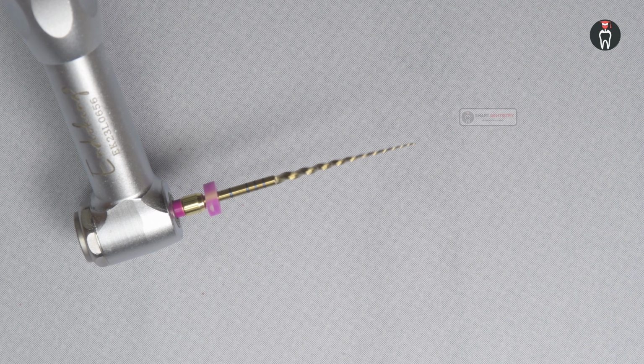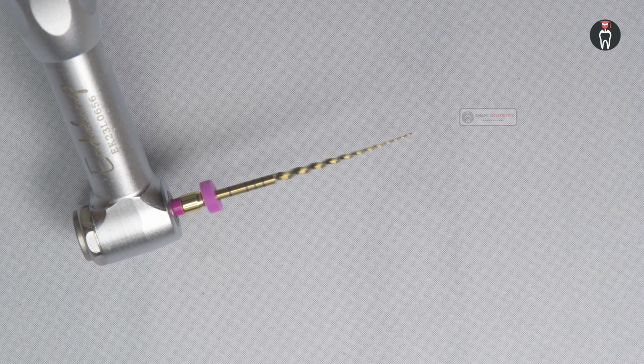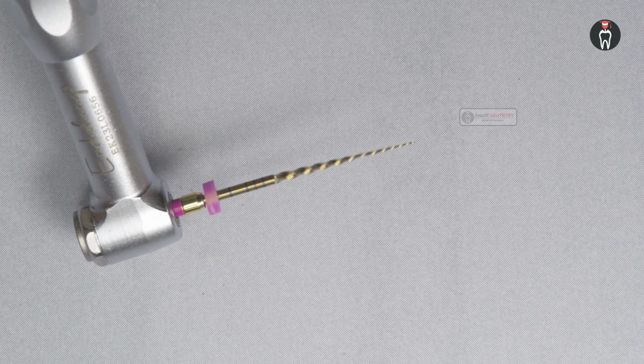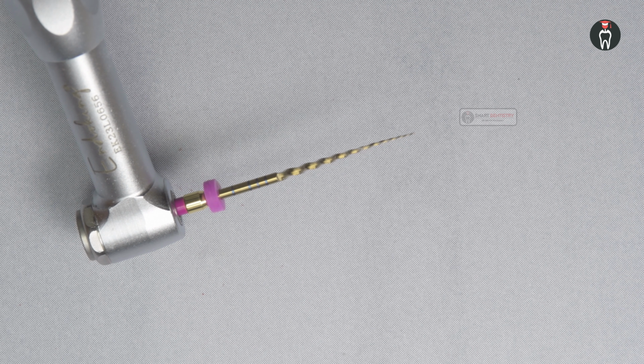But the problem is that the cutting efficiency with reciprocation is much less compared to rotation. So if you frequently encounter screw-in of the file inside the root canal system, for the initial preparation, maybe preparing the coronal third and the middle third, you can use a reciprocation motion, because that will not screw inside the root canal. Once that is cleaned and shaped, you can put your endomotor or the file in a continuous rotatory motion, and then prepare the remainder of the canal.